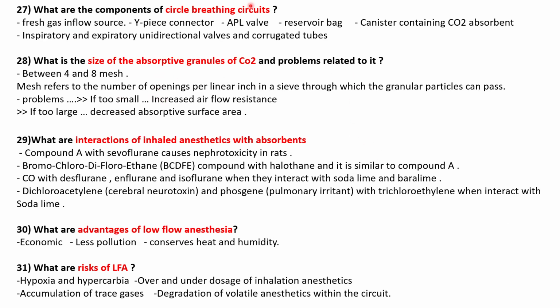What are the components of the breathing circuit? Fresh gas inflow source, Y connector, APL valve, reservoir bag, canister containing CO2 absorbent, inspiratory and expiratory unidirectional valves, and corrugated tubes. What is the size of absorptive granules?